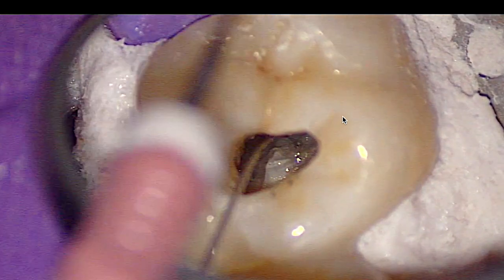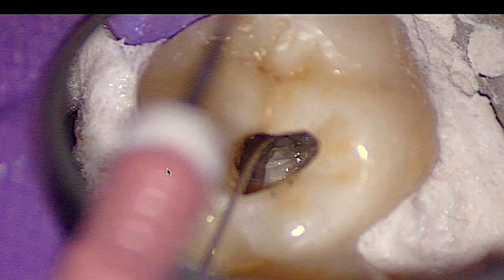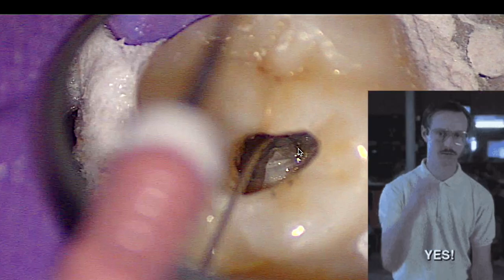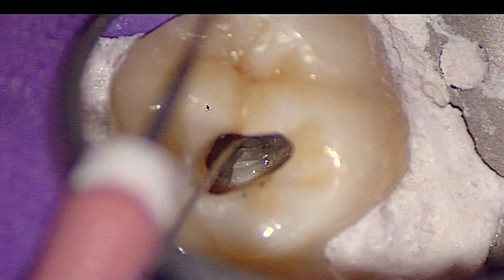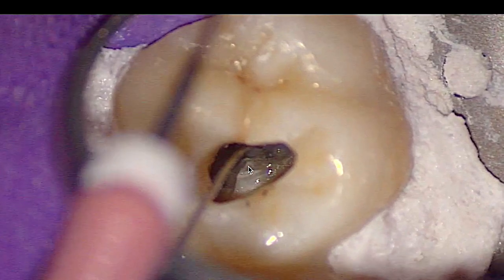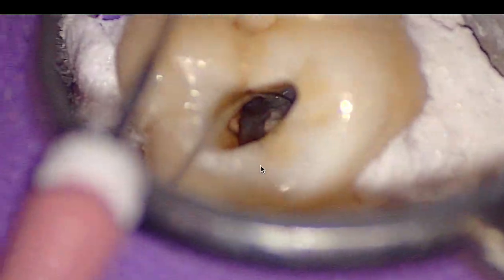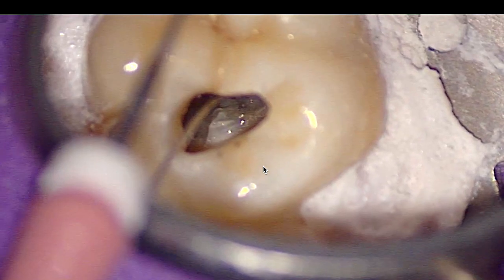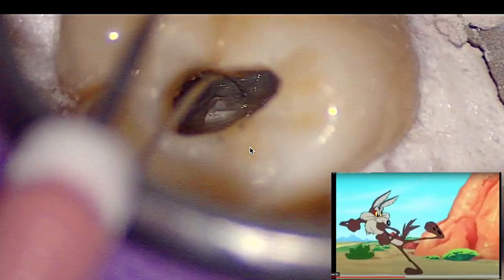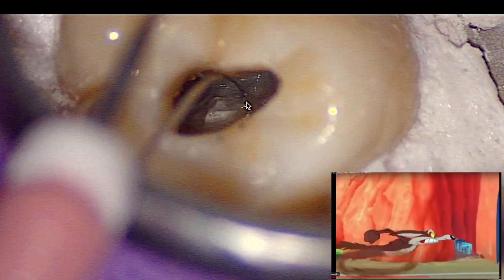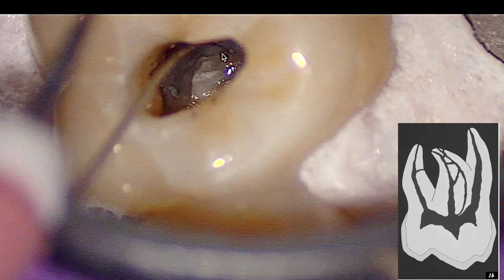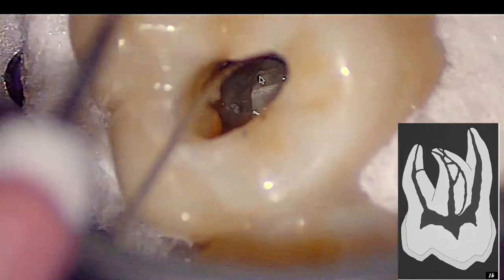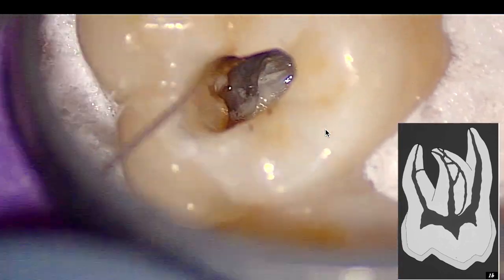So this is what we normally all do. We see that canal, we see the orifice, we take a small hand file — this is a number six file in a 21-millimeter length. You take a six file and you're like, yes, I am in. I got the handle flutter — if you're not familiar with that, the handle will flutter if the tip is stuck into something. It's almost like Looney Tunes. The problem is that file wants to progress apically, but the canal is not going apically — it's actually moving mesially.